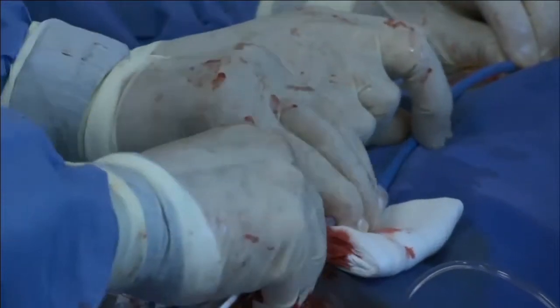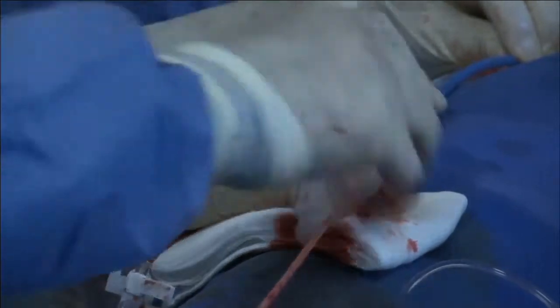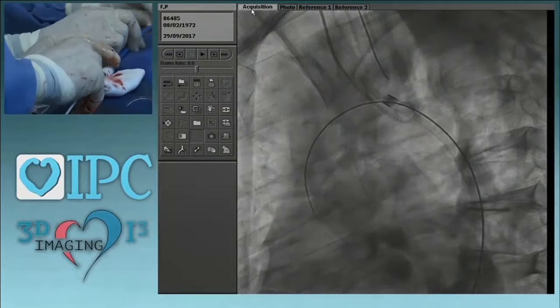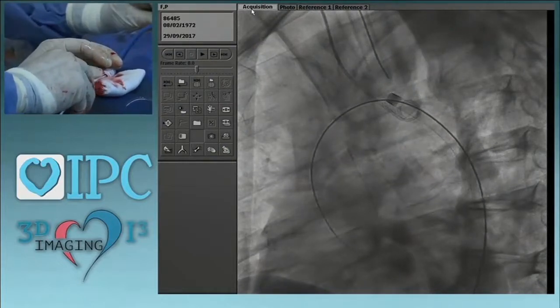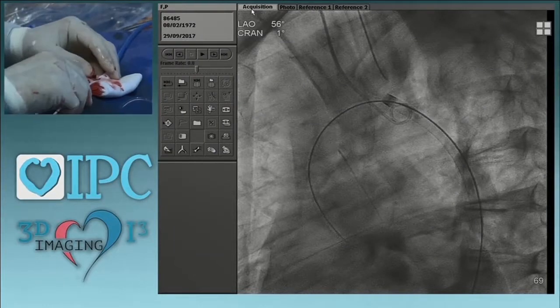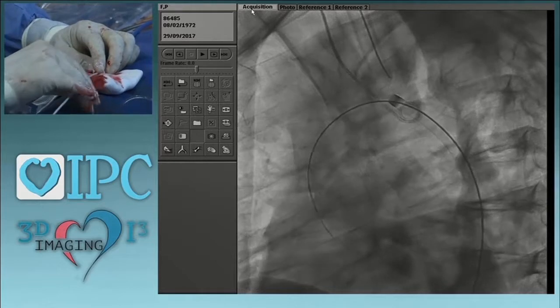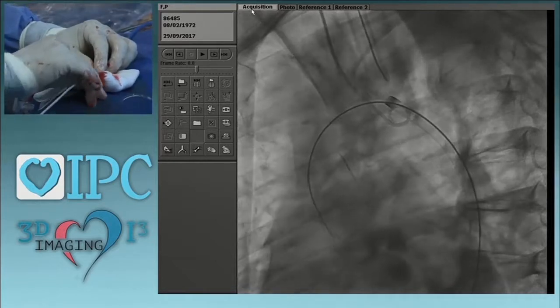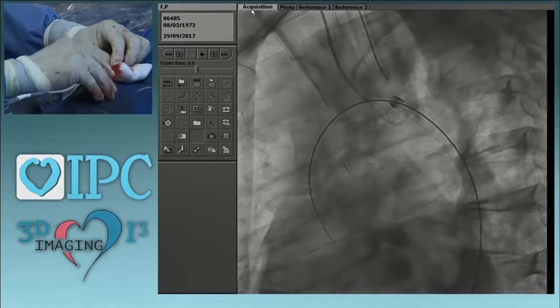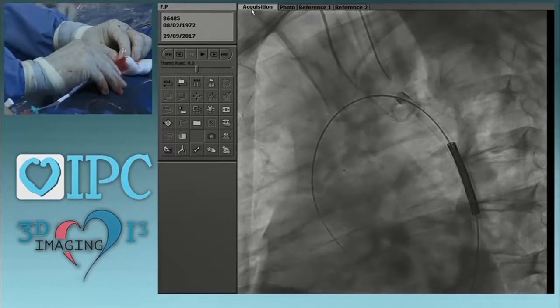Fluoro, ragazzi, fluoro. We need to see the fluoro here. You see the catheter in the ascending aorta is even a bit too far for what is needed. Yeah. And we have the pigtail catheter in the horizontal aorta to check from above the exact positioning of the stent itself. Because if you have seen, there is a kind of offset.